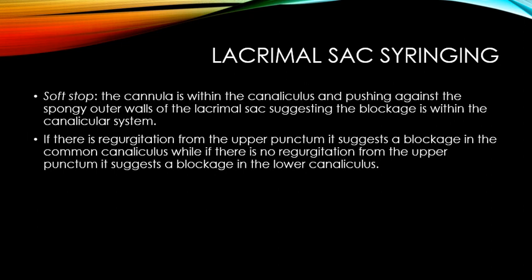The other possibility is you may not be able to insert the cannula into the punctum itself, which means the punctum is stenosed. Again, that is a reason for the watering. Obviously, you can make this out based on clinical examination, and you don't need to do the sac syringing. The soft stop means you are not able to pass the cannula into the sac and it's not touching the bone. So the obstruction will be somewhere within the canalicular system. So this is obstructive pathology.